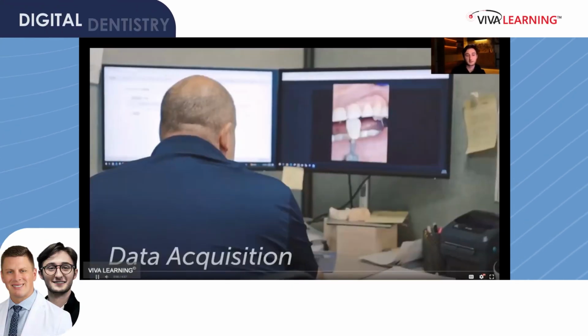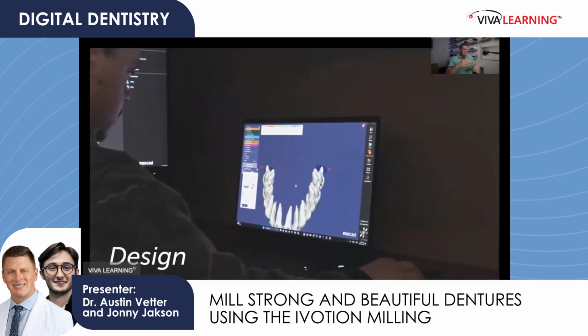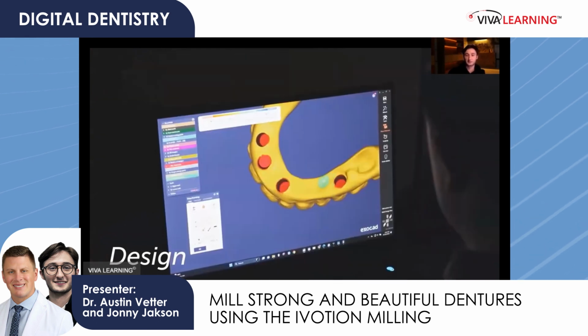This is the modern day type of dental laboratory. It all kind of starts at data acquisition. Then you'll move on to design. So data acquisition, that entails intraoral scanner, box scanner, PVS impression, whatever that means for you, right?